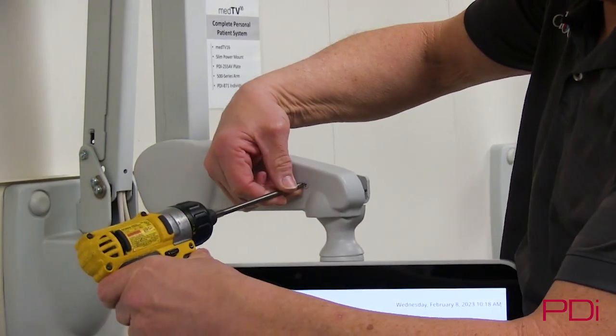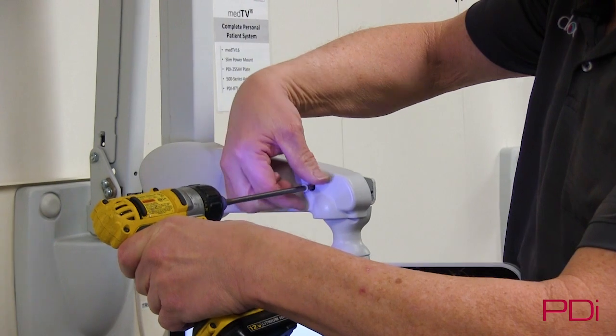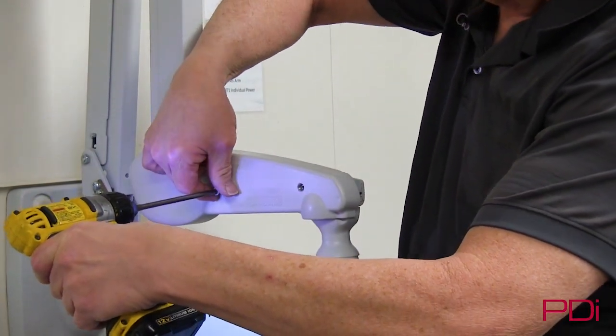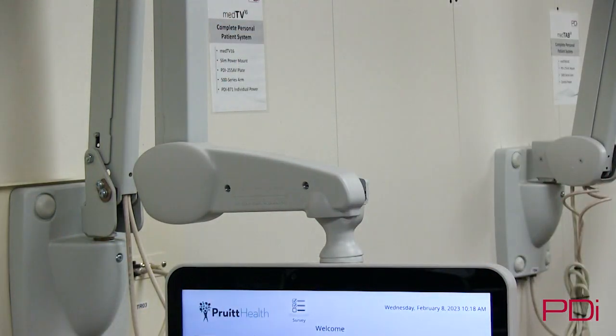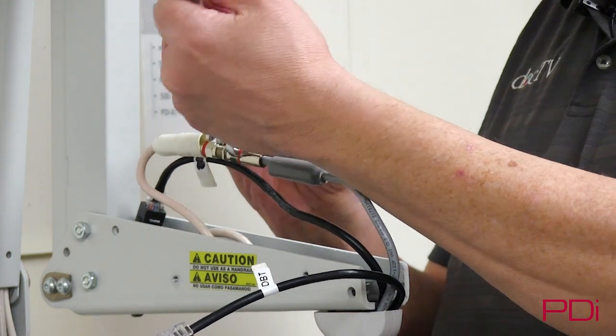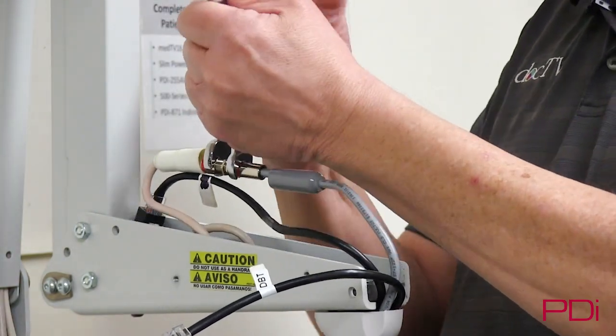First, you start by taking all the screws out here on the plastic cover, just take them loose. This is a 12-volt driver that doesn't have a lot of power, and that's what you need. You don't need a very big 18-volt driver to take this apart.